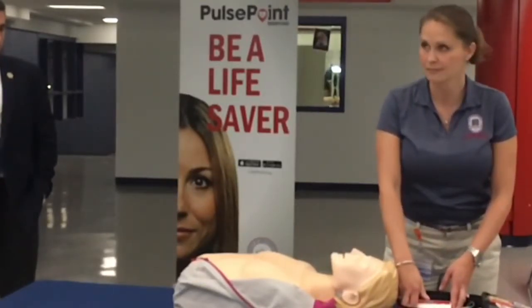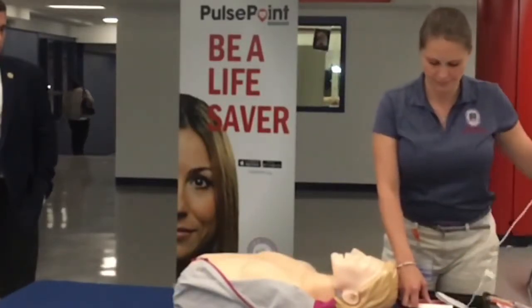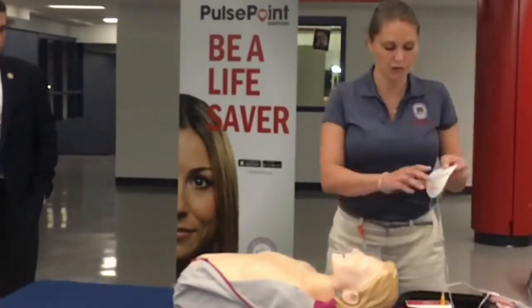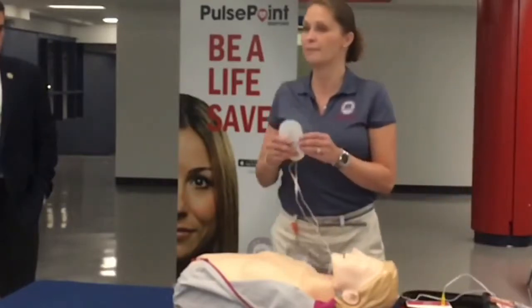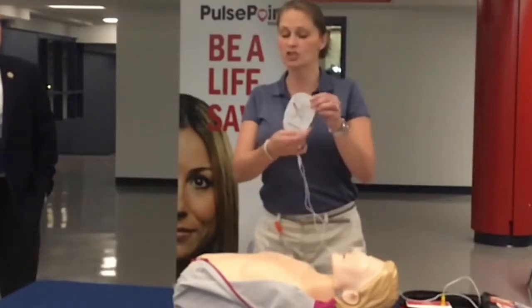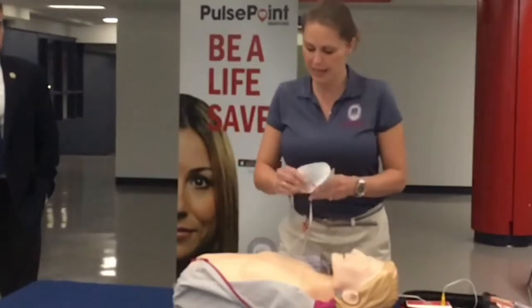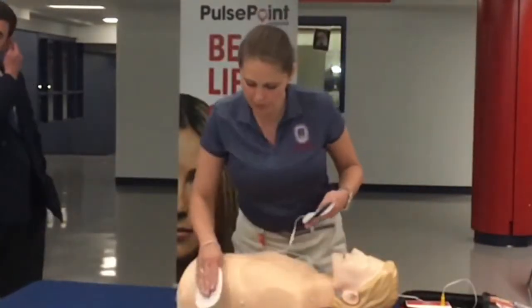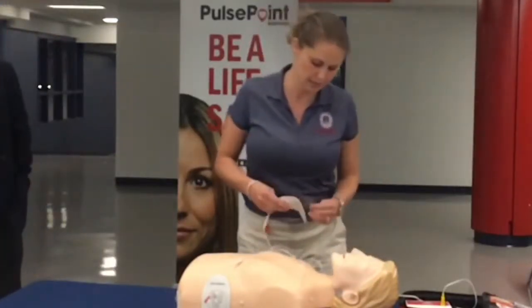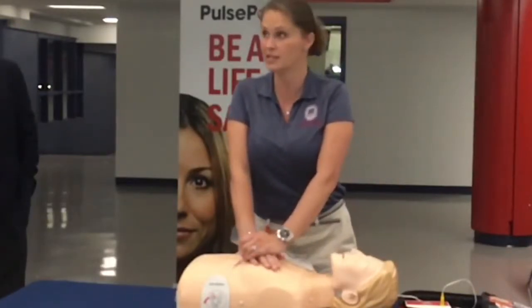The device instructs: apply pads to the patient's bare chest, and plug in the pads connector next to the flashing light. I'm going to pause it and plug the pads in. The pads actually have pictures on them — they're not designated to a specific place, but the pictures show you where the pad placement should be. So this pad we're going to place right here, and then according to the picture, this pad we're going to place right here. This can be done while somebody is actually performing CPR.